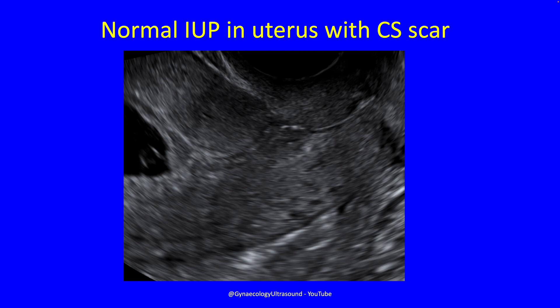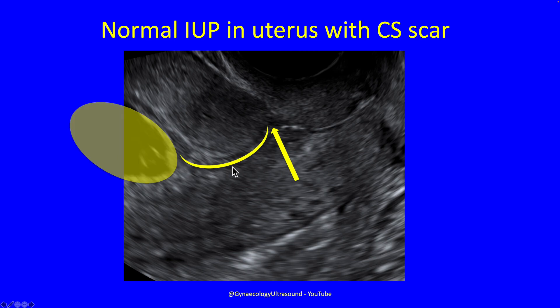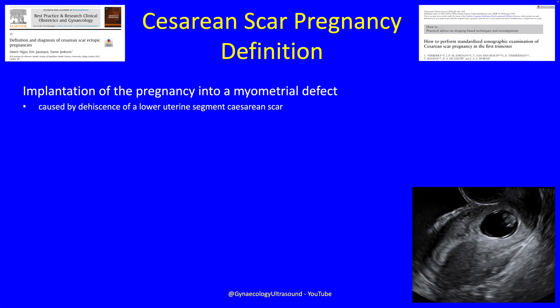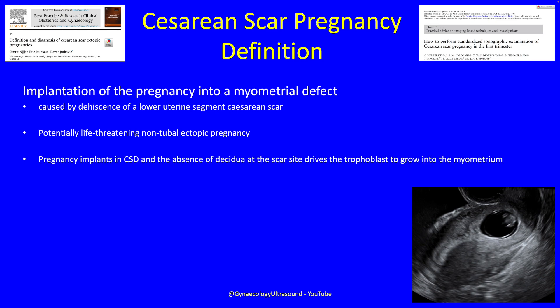So once somebody gets pregnant who's had a caesarean section, what does that look like? There is the section scar; here's the internal cervical os, and then there's a pregnancy — the pregnancy is nowhere near the scar, which is normal. But sometimes the pregnancy implants in the scar — that's called the caesarean scar pregnancy, where the pregnancy is implanted into the defect caused by dehiscence or non-healing of the section scar. It's a non-tubal ectopic pregnancy that can be life-threatening, and the trophoblast grows into the myometrium and the tissues beyond.